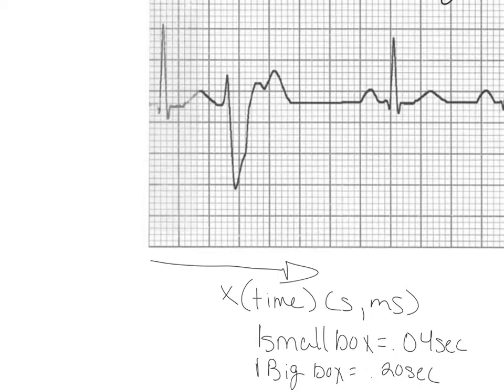Alright, I'm not going to go too much into that. There is going to be a separate video for intervals and segments and waves and how to apply that to the waves themselves that we see there. So wait for that or watch it when you get a chance. But what I do want to say with these values is that these values will remain true if the paper output, how fast the paper is being printed out, stays the same. Okay, stays standard.